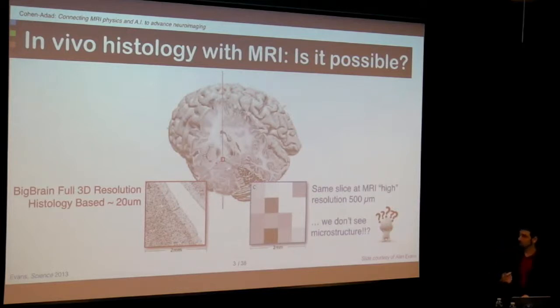MRI is, but it's not very intuitive. Knowing the image resolution of MRI, which is usually 1 millimeter or 2 millimeters, how with a 1 millimeter big pixel can we have information about the number of axons, or how they connect to each other, or how they activate?